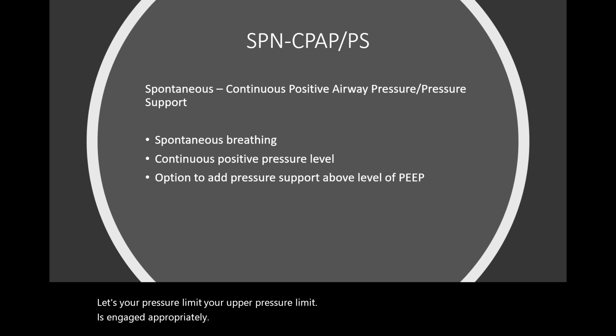Right, moving on to spontaneous breathing with spontaneous CPAP pressure support. This mode is what we use in patients that are spontaneously breathing.